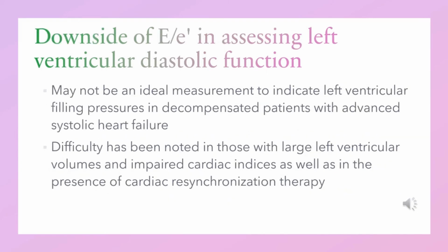Now, what are the downsides of E by E prime in assessing left ventricular diastolic function? It may not be an ideal measurement to indicate left ventricular filling pressures in decompensated patients with advanced systolic heart failure. Difficulty has been noted in those with large left ventricular volumes and impaired cardiac indices, as well as in the presence of cardiac resynchronization therapy or biventricular pacing.